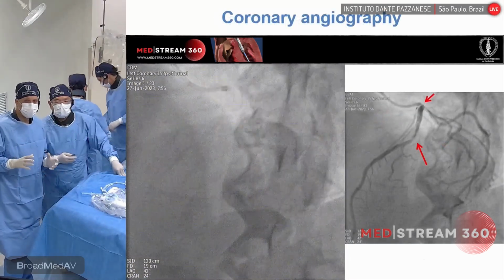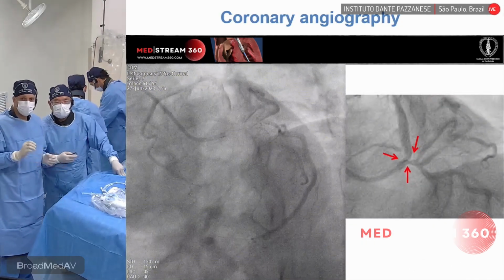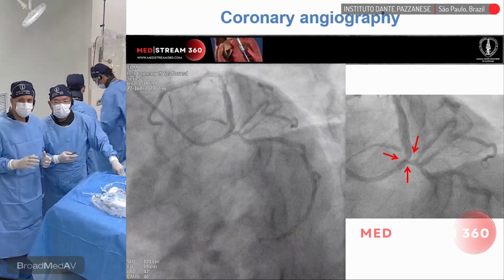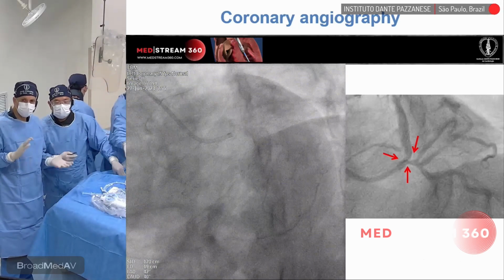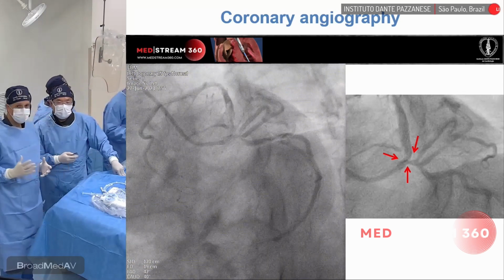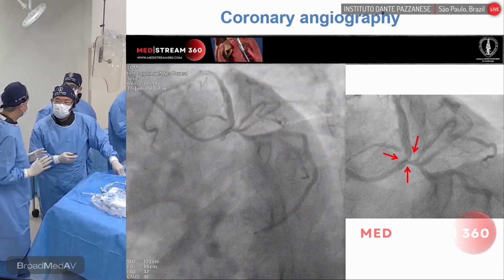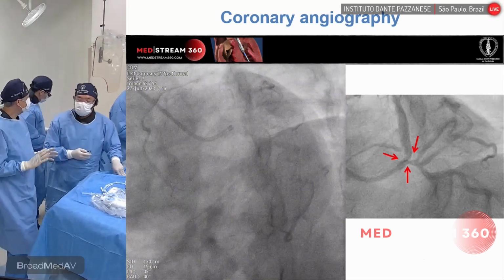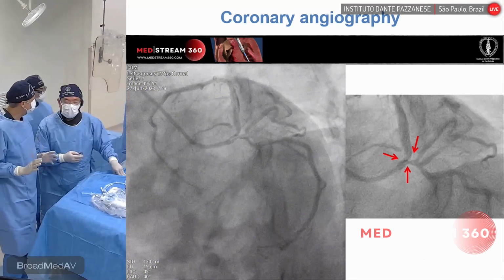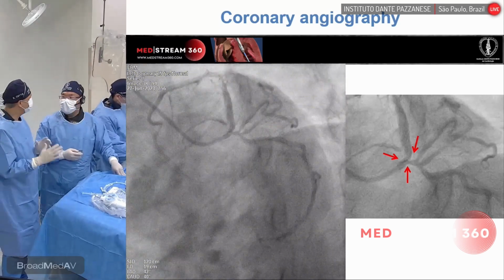And now we are in a situation where you have this ambiguous lesion in the left main. I see some disease in the proximal LAD as well, and also in the proximal circumflex there is definitely some disease, but again, it's not very clear how critical it is. So in a case like this, Louis, this patient technically has multivessel disease, right? Yes. Can we feel very confident that we can see a culprit lesion here for his acute event, or is everything a little bit ambiguous?